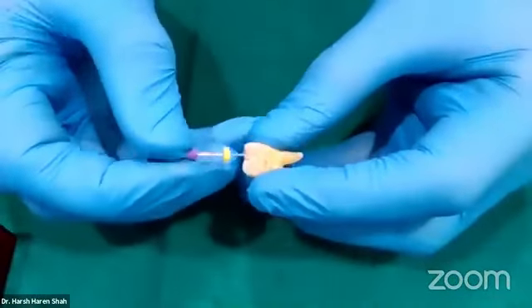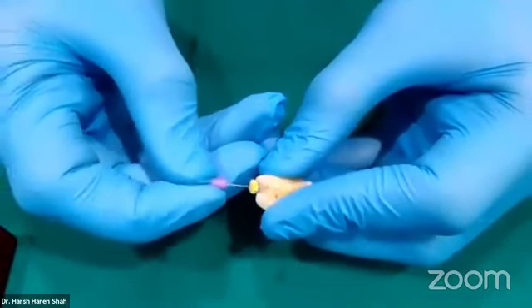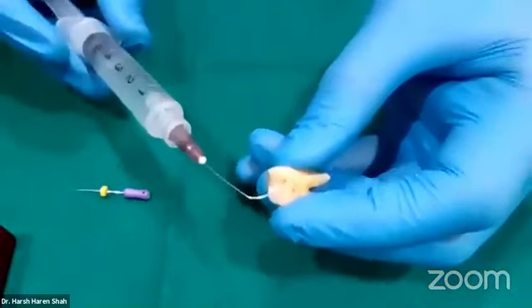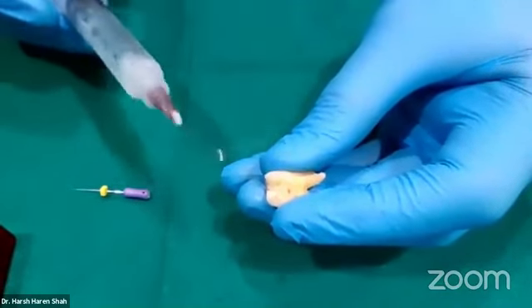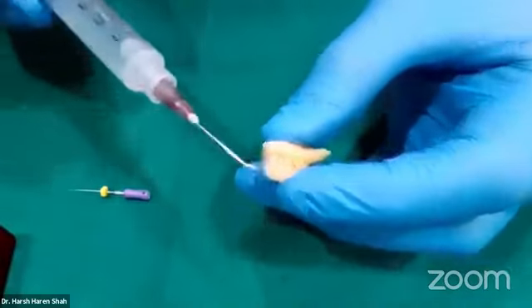Every time that I'm done with my watch winding, I also use my file in a filing motion like this. When I use it in the filing motion, I'm basically smoothing out all the root canal walls. After this step, I will be using my irrigant one more time. And I just want to remind you, although it is out of the purview of this presentation, all the irrigation that you carry out during instrumentation will only be concentrated sodium hypochlorite. You do not need to use any saline, distilled water or sterile water in between. So I will just irrigate this canal a little bit.